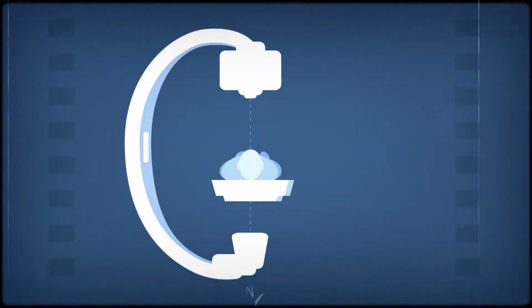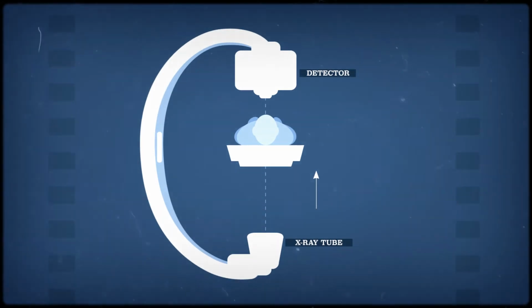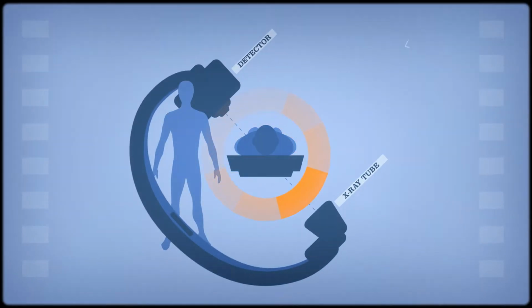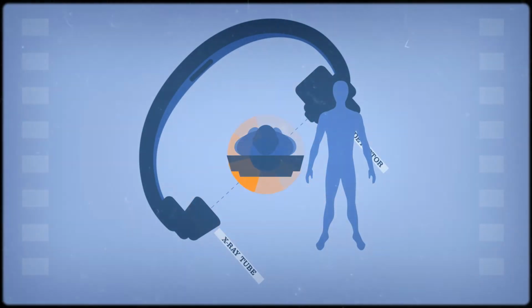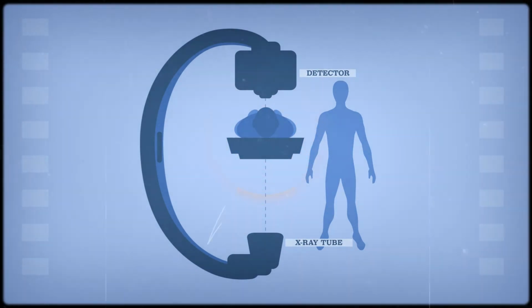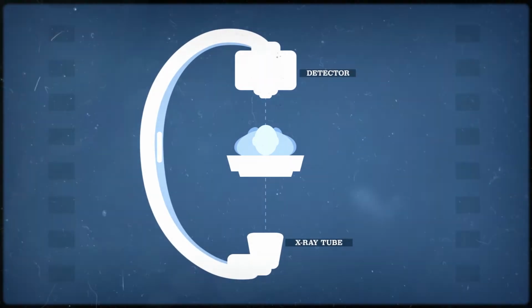Another key is to keep the patient away from the X-ray tube and close to the detector to minimize skin dose. Scattered radiation is primarily back towards the X-ray tube, so where possible, operators should stand on the detector side during lateral views. In addition, having the detector close to the patient can help reduce scatter in the room. Avoiding steep angulations, which increase the thickness of tissue the beam traverses, will also decrease dose.